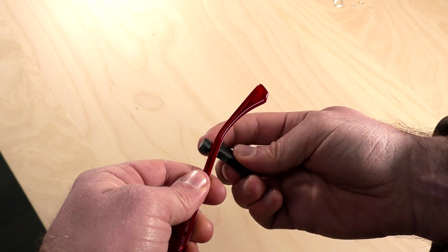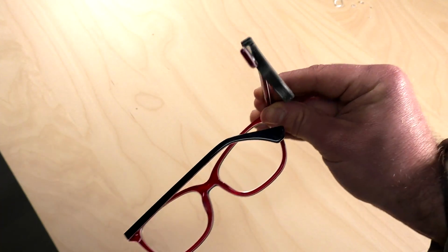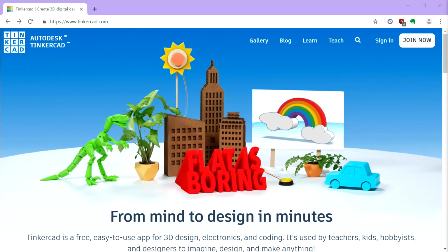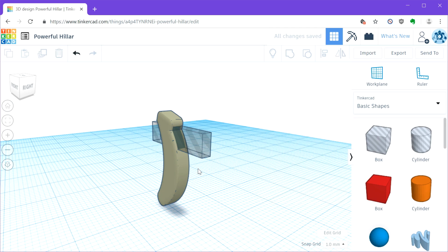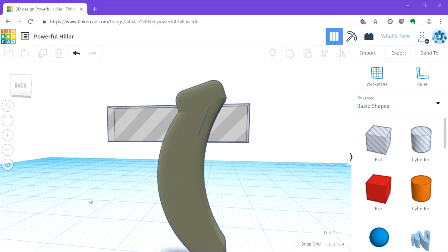If your glasses have a very thick earpiece, but a thin temple, then create something like this and push it in place. Because glasses come in a million different shapes, I'm including a blank design as well. You can then use Tinkercad and create a hole of any shape and size that you need for your specific glasses.